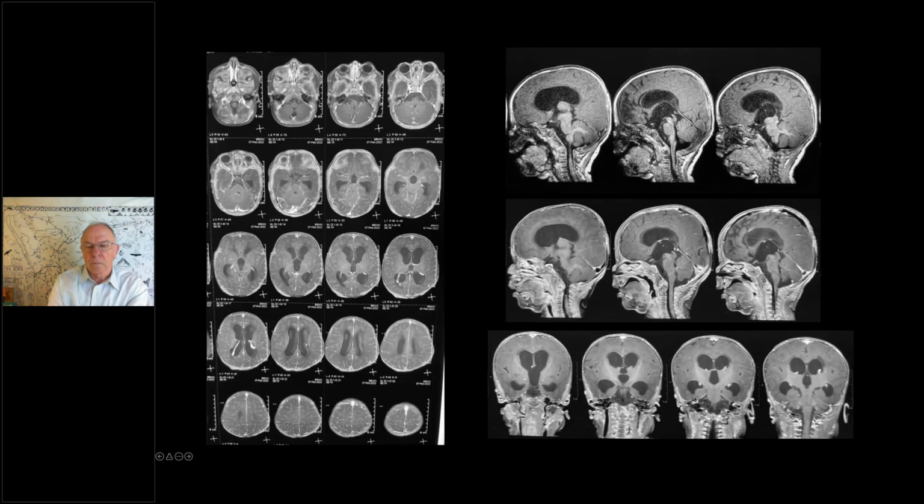On the post-contrast sagittal and post-contrast coronal images, you can appreciate the supratentorial ventriculomegaly. The fourth ventricle demonstrates normal appearance. The likely cause is an obstruction at the level of the aqueduct of Sylvius.